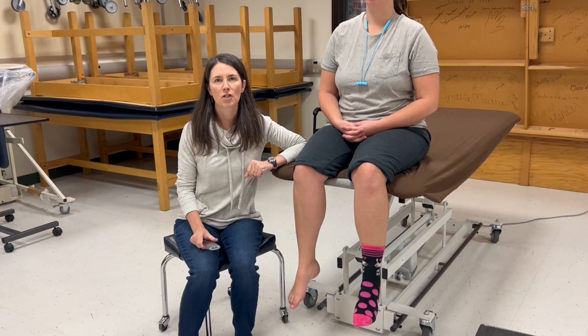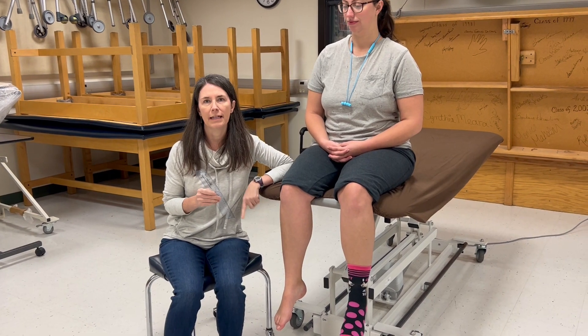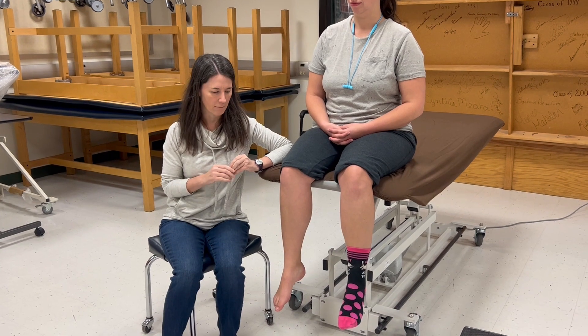In this video we're going to demonstrate how to measure active range of motion for ankle inversion and eversion using a goniometer, as well as manual muscle testing for ankle inversion and eversion.